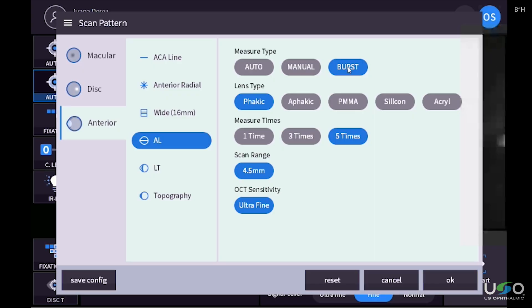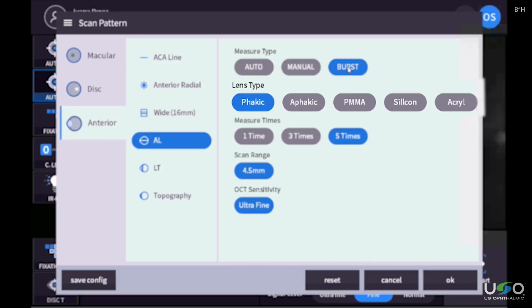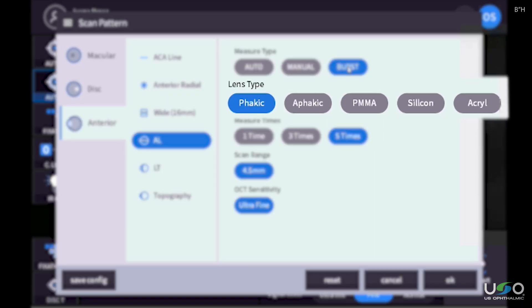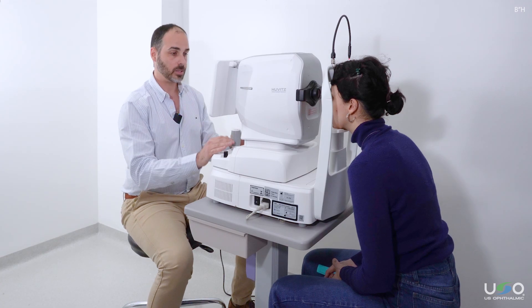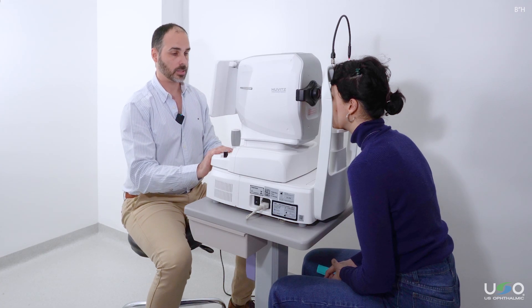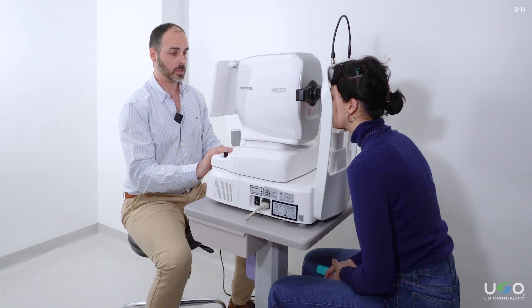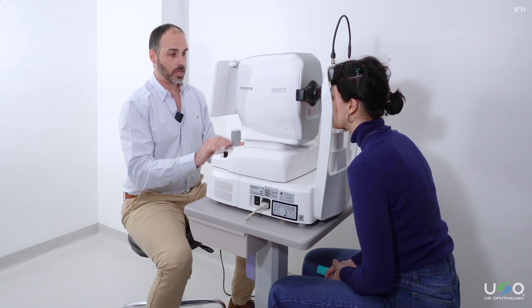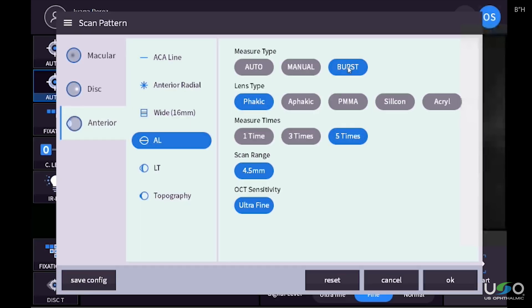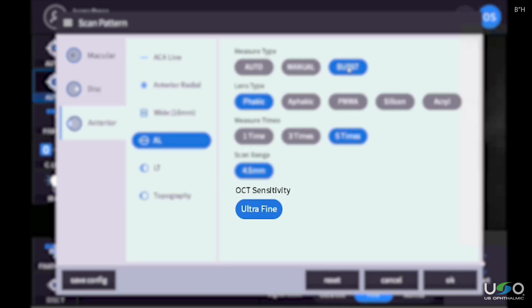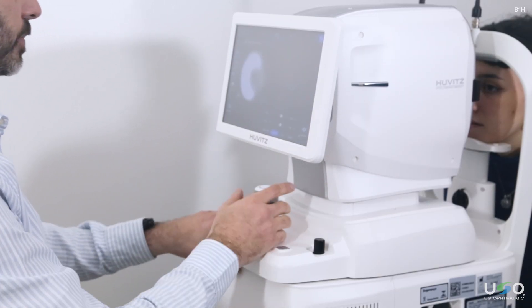We can also choose whether it is a FACIC lens, a PMA, silicone, or acrylic. In this case, we select five measurements, so it will be an automated sequence of five measurements simultaneously. And we have the 4.5 millimeter range and ultra fine sensitivity. Click OK.